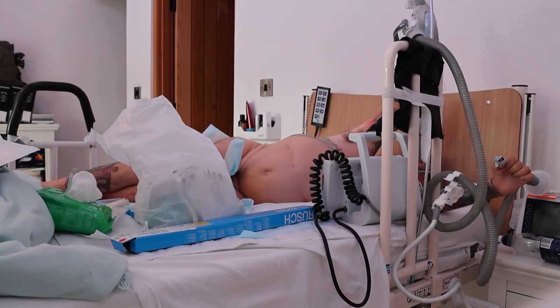This is a suprapubic catheter change, and we're doing it because I've tried absolutely everything. He's doubly incontinent right now, and my judgment is that the infection has probably pulled or pushed the catheter out a little bit. I was able to get a urine sample from the other end, and it came up with blood and protein, so he's on antibiotics. I've decided to go straight in for a catheter change — no messing about.